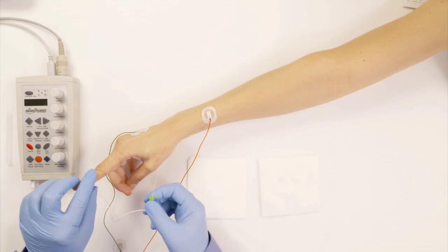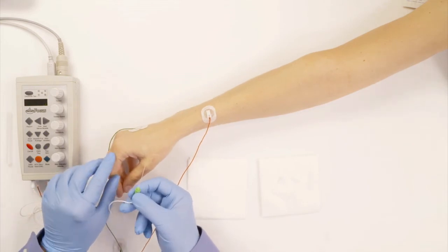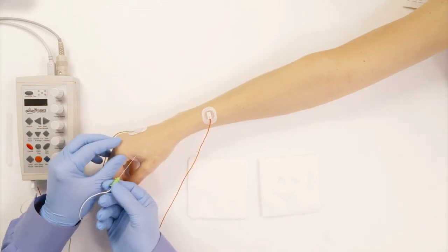So now I stick the needle in the muscle. Now relax. I only stick the needle in the muscle when the patient is relaxed. So here we go.